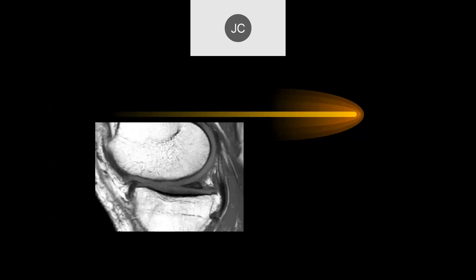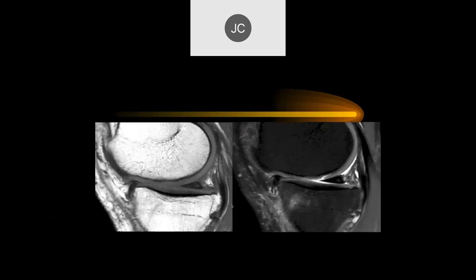This is a T1-weighted sagittal image, and this is the reason why we don't do T1 sagittal images anymore. Here's what the PD fat sat looks like — there's a cartilage defect along the weight-bearing surface of the femur. We can see a flap tear here — a little flap, so it's all unstable.